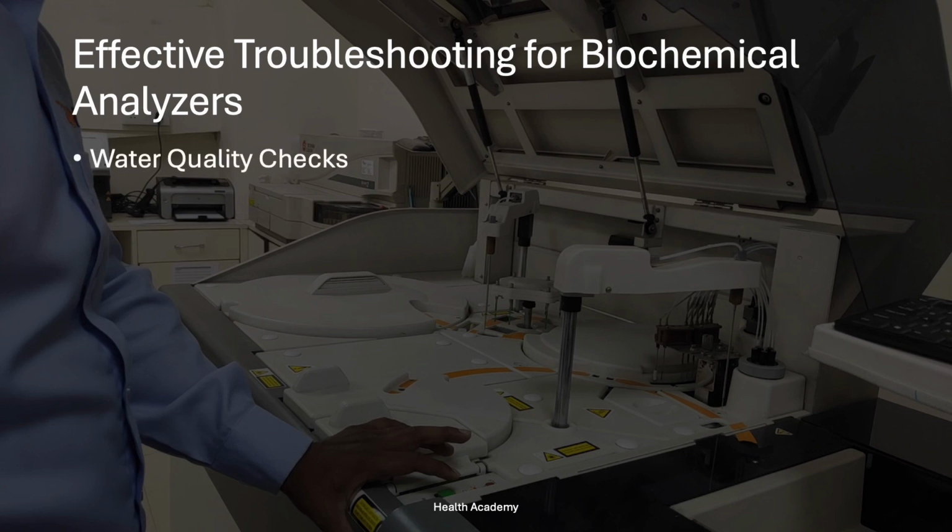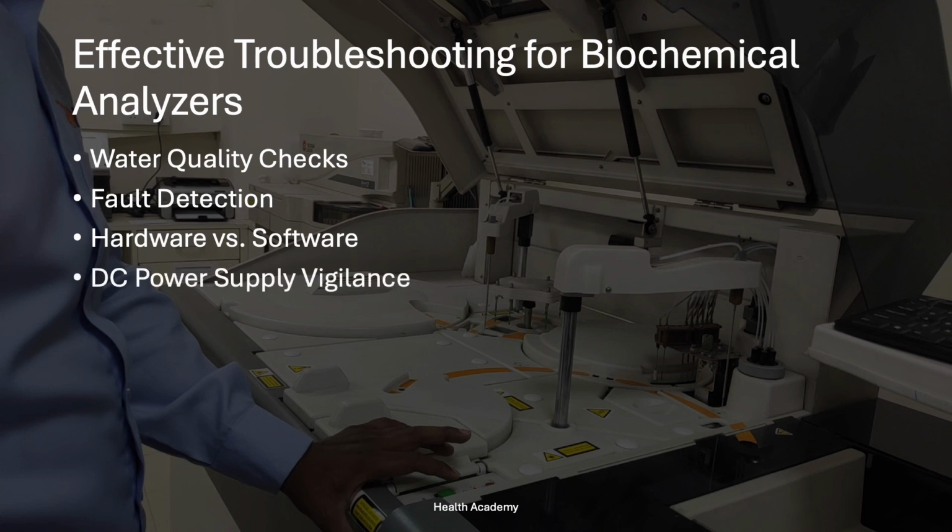Water quality checks. Ensure the use of high-quality reverse osmosis water for the washing processes. Fault detection. Utilize built-in error reporting functions to facilitate faster problem identification and resolution. Hardware versus software. Assess instrument repeatability to determine if issues are hardware or software related. DC power supply vigilance. Monitor the output voltage purity and value as part of your initial equipment checks when an issue arises. Maintenance strategy. Adopt a structured approach to understand the equipment's function for efficient and rapid repairs.